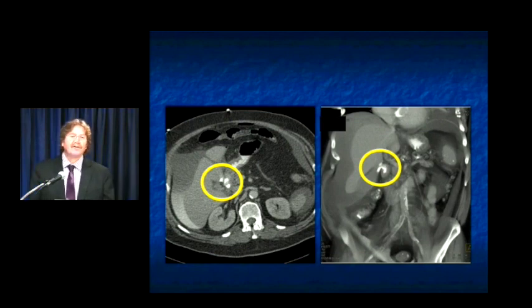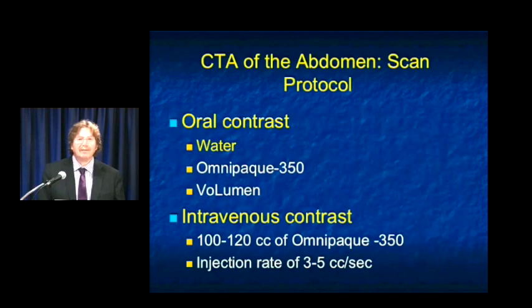So positive contrast material is something we use routinely in our oncology patients, following up cancer of the pancreas, cancer of the colon, lymphoma, and the like. Also, if you can't give IV contrast, you'll always use positive oral contrast material. There's a very tiny risk, theoretically, of a severe reaction to iodinated contrast with PO. Usually with PO, it's so dilute that it's not going to be an issue. There are only a few reported cases of reactions. If you're really concerned in those cases, I would use a barium-based solution. So that's pretty rare, but it's something to keep in mind.